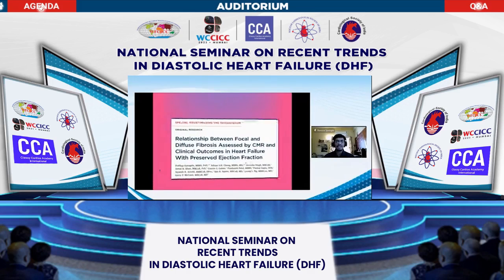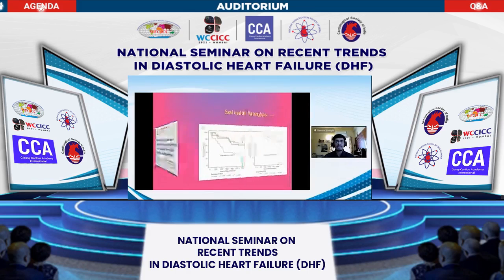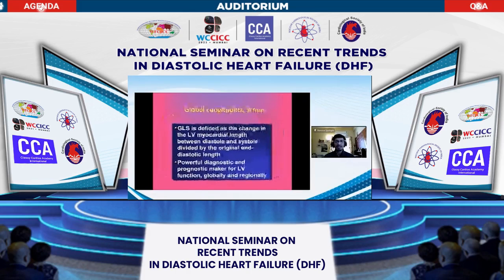The highest ECVs are generally with patients with amyloid, especially TTR amyloid. And there's a paper looking at the relationship between focal and diffuse fibrosis. What it showed is that the event-free survival is quite good if you have a T1 ECV which is not very high, but in the fourth quartile, with very high ECV, you can see how different the event survival curve is, and that can be seen also over here. So the ECV now has a bearing on cardiovascular mortality as well.